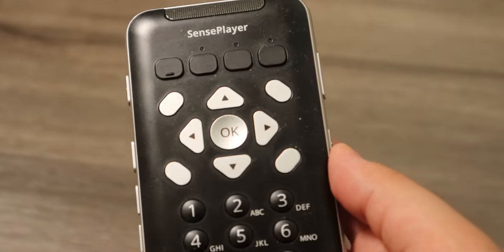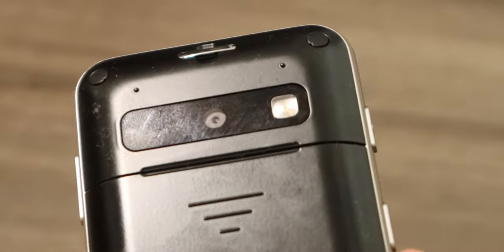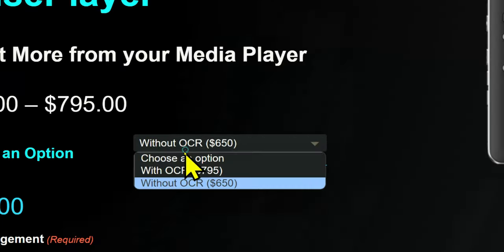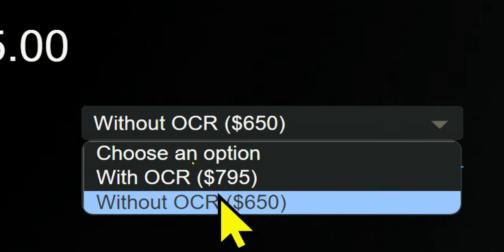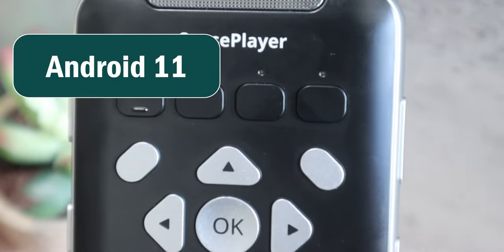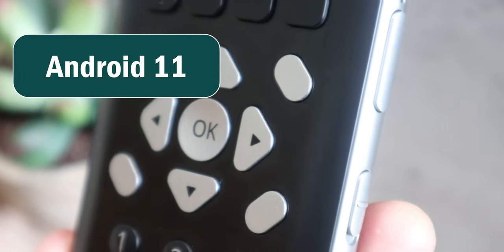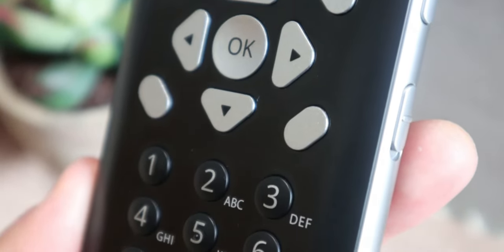There are actually two versions of this device. This one has OCR and a camera at the back, but there's also another version with no camera if you're not interested in its OCR functionality. Right now it's running Android 11, which is a bit disappointing, especially since they mentioned they want to put a screen reader on here and be able to use Android apps independently on the device.